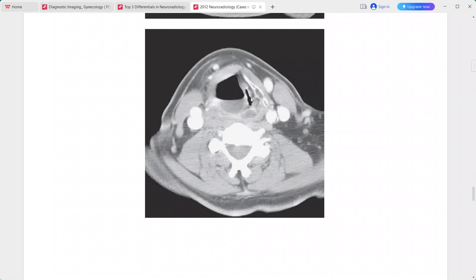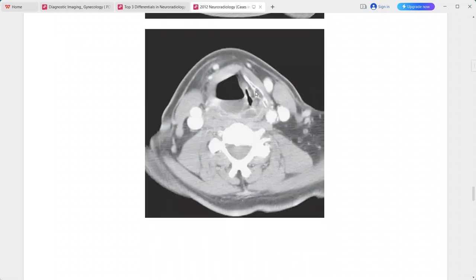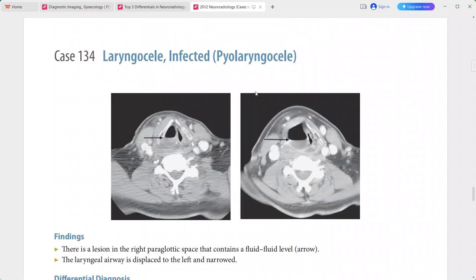The laryngeal airway is displaced to the left and is narrowed. This lesion has a fluid-fluid level and is displacing and narrowing the airway. This is a case of infected laryngocele — specifically a pyolaryngocele. Differentials include saccular cyst, ventricular appendix, thyroglossal duct cyst, or cystic tumor such as squamous cell carcinoma.